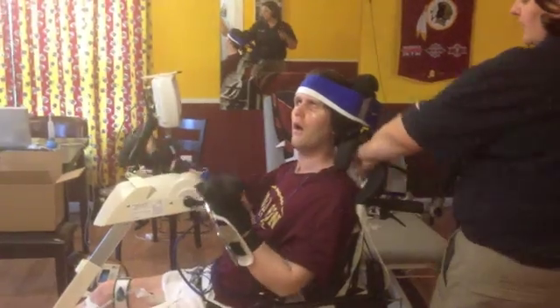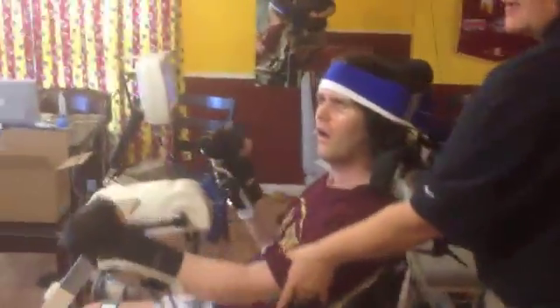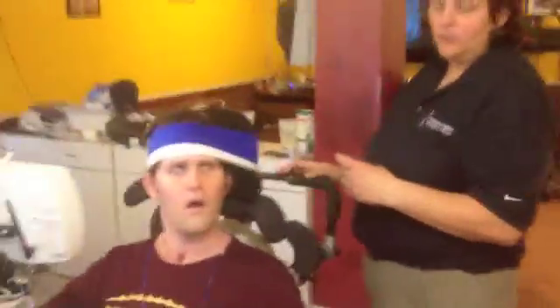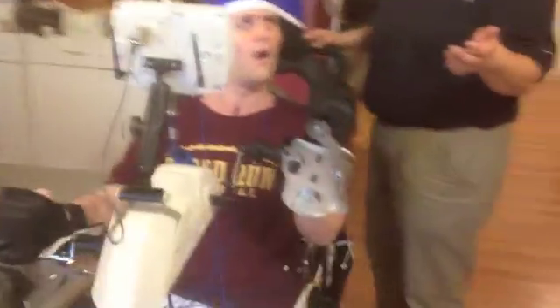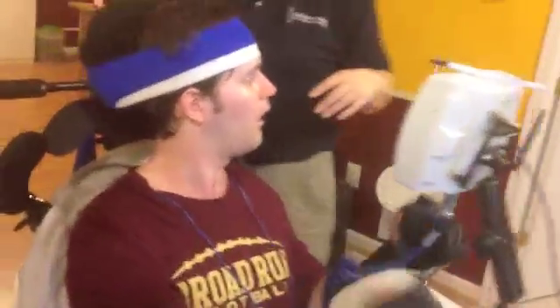The shoulders turn on for 10 seconds — it takes 10 seconds to ramp up to where they need to be. These muscles will be passive while the motion is being introduced. Once it goes through that one minute of warm-up time, the other channels will turn on and they ramp up at 1% per second, so it doesn't just jump right to his minimums. If he's getting 25 milliamps of stimulation, it still goes up at 1% per second — currently getting anywhere from 28.